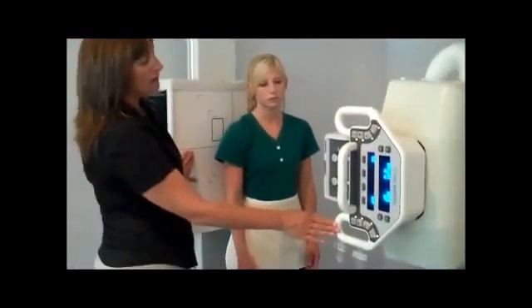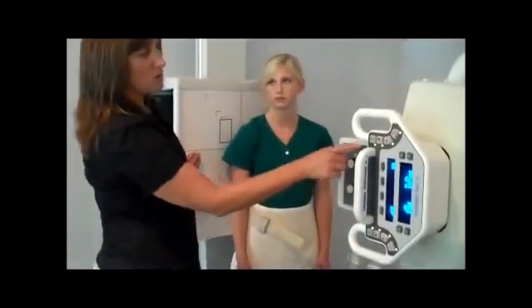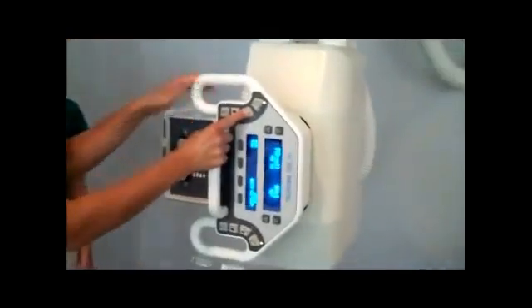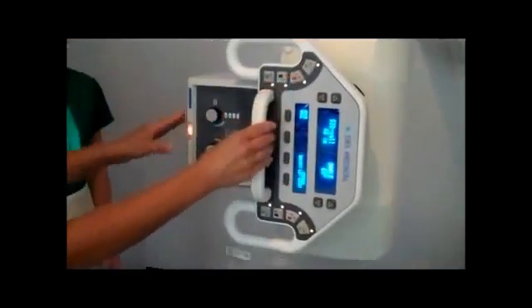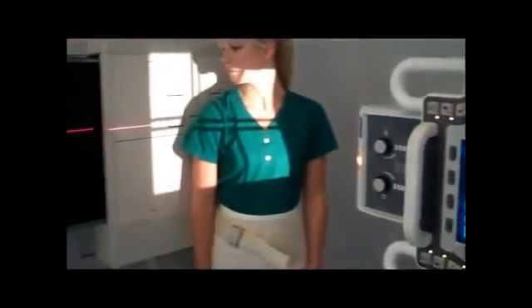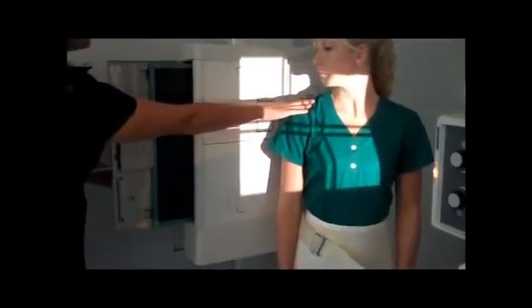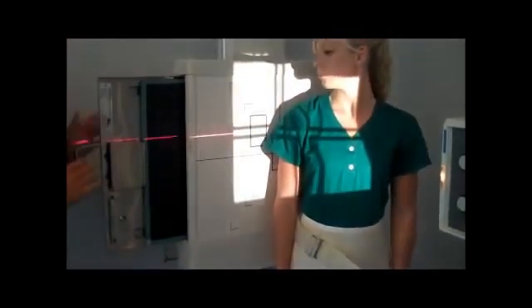We're going to detent the upright to the upright bucky at 40 inches, and also make sure that your transverse detent is locked in since we're using the bucky. A 14 x 17 image receptor is placed lengthwise, and we'll adjust the height so that it's an inch and a half above the humeral head.